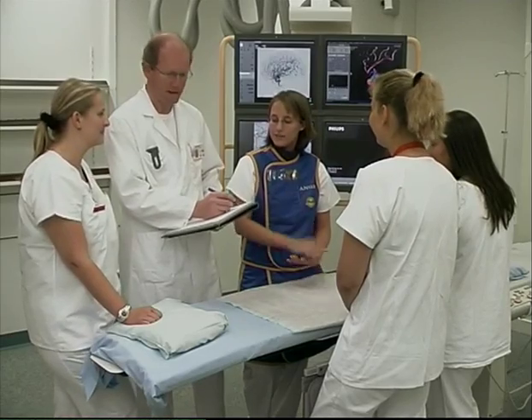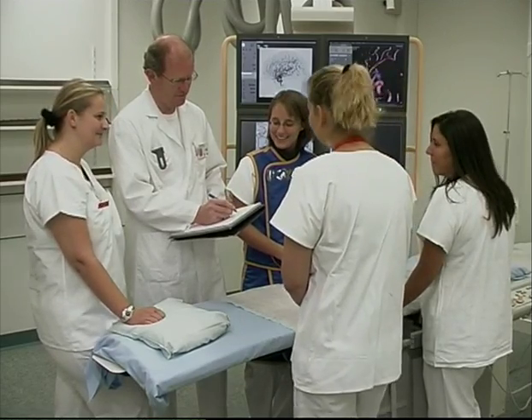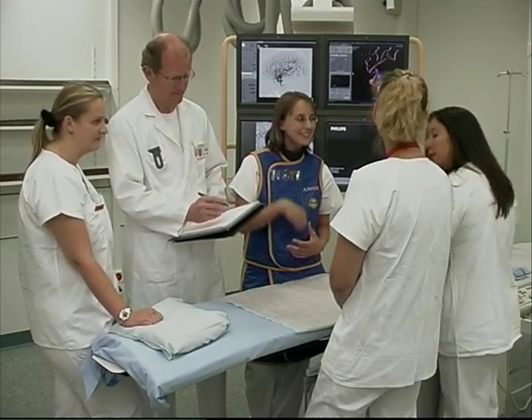Advanced team planning on how best to implement the radioprotective measures shown here is essential. An additional measure of great importance are the diagnostic reference values published by the authorities.